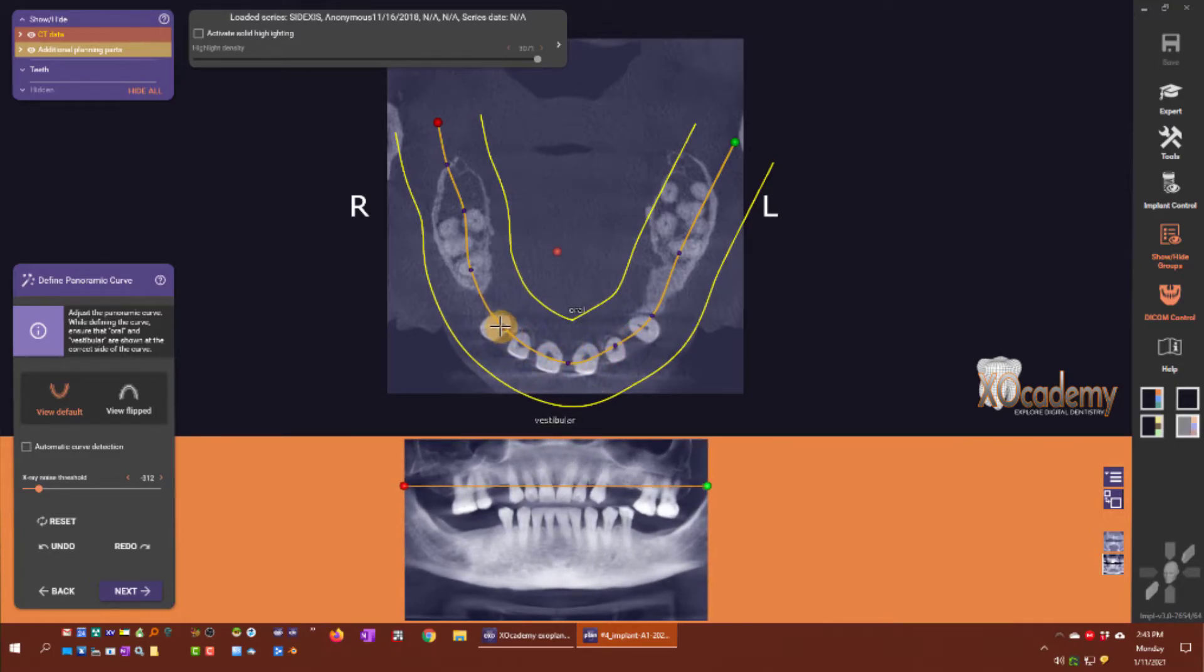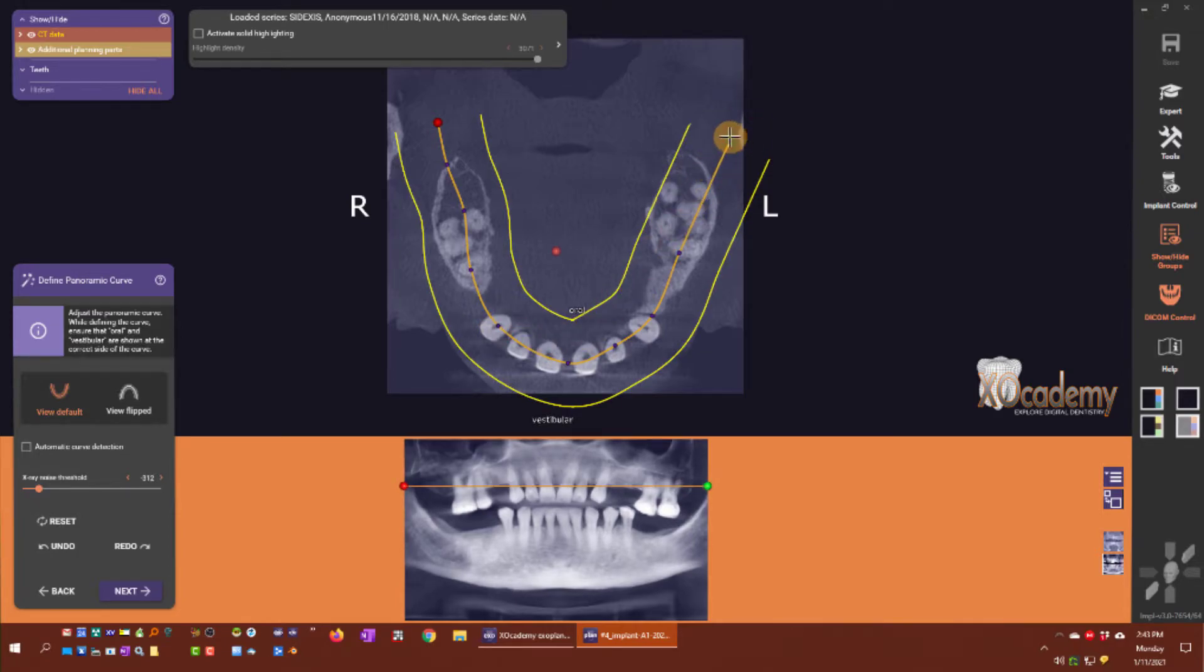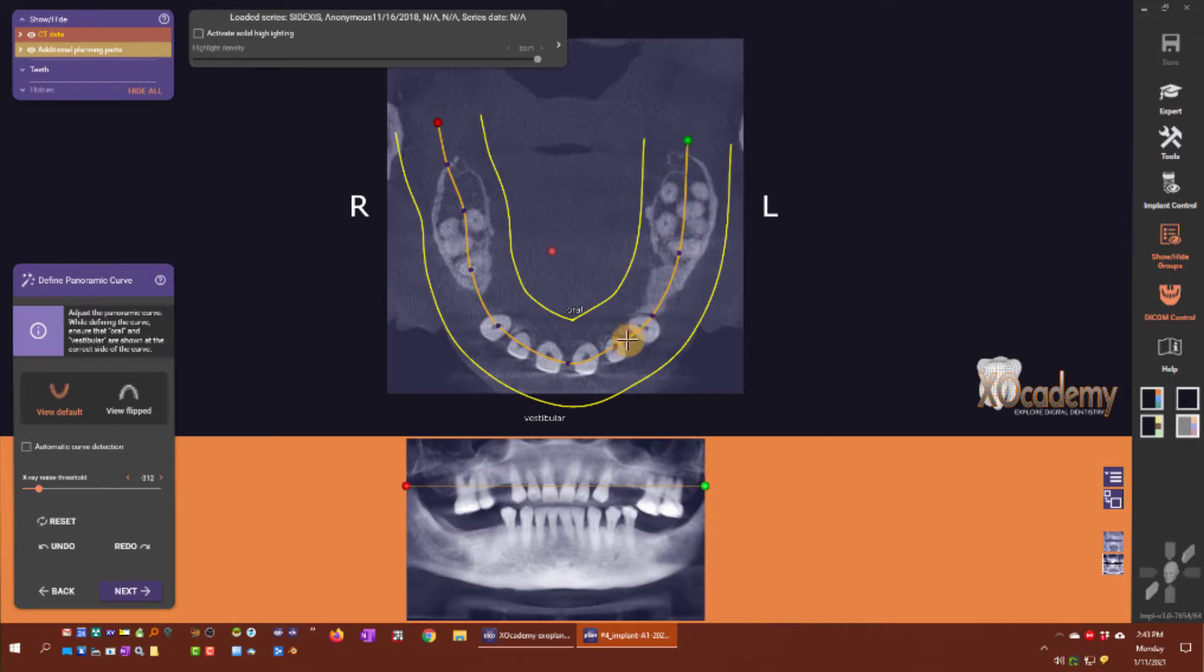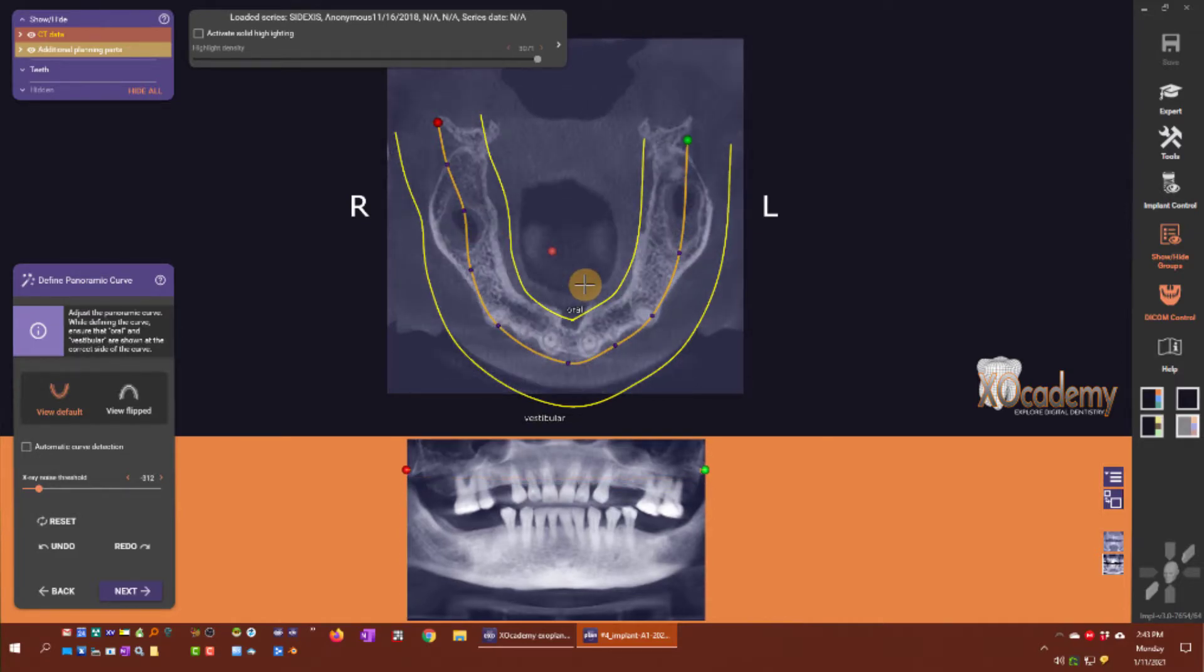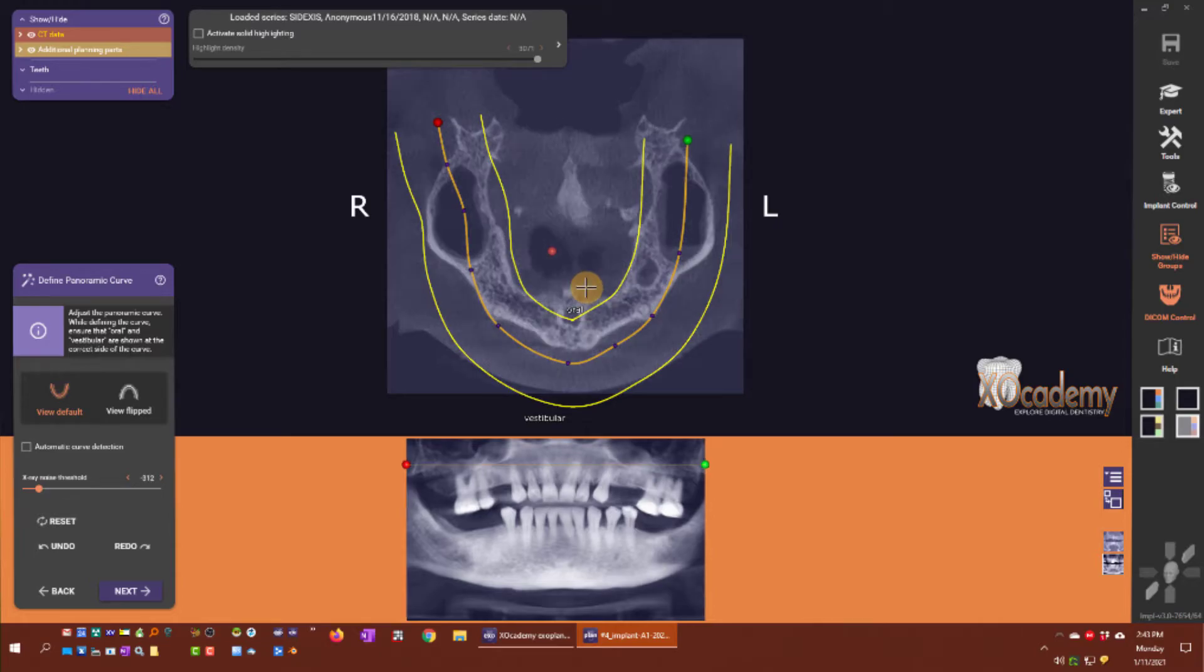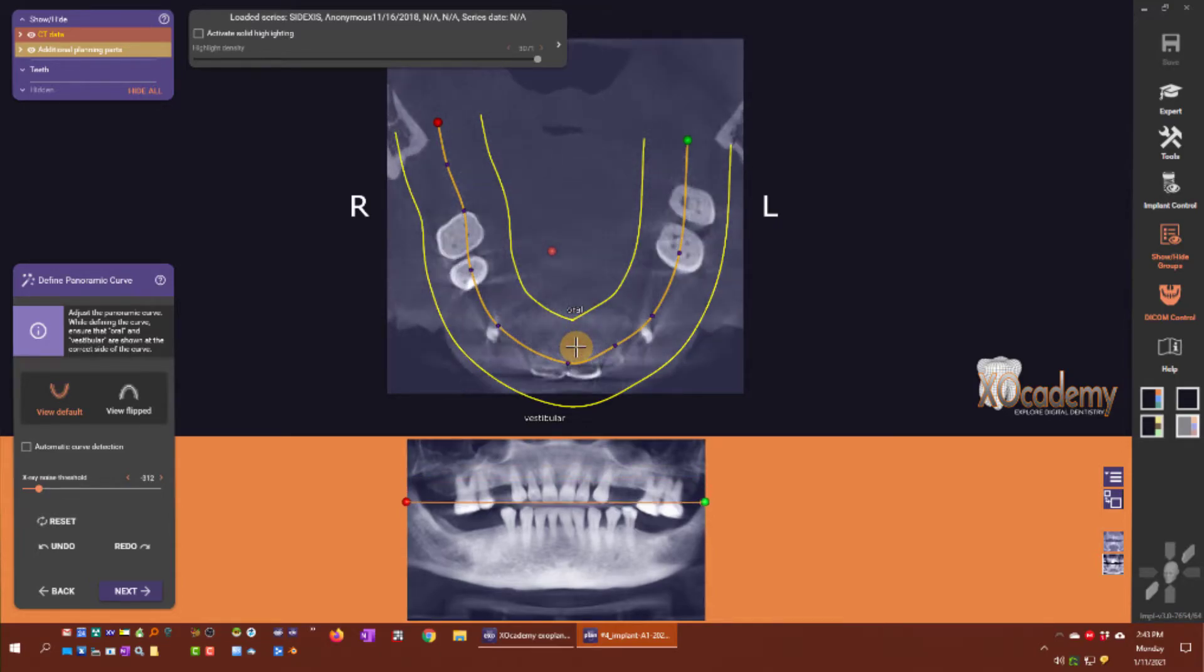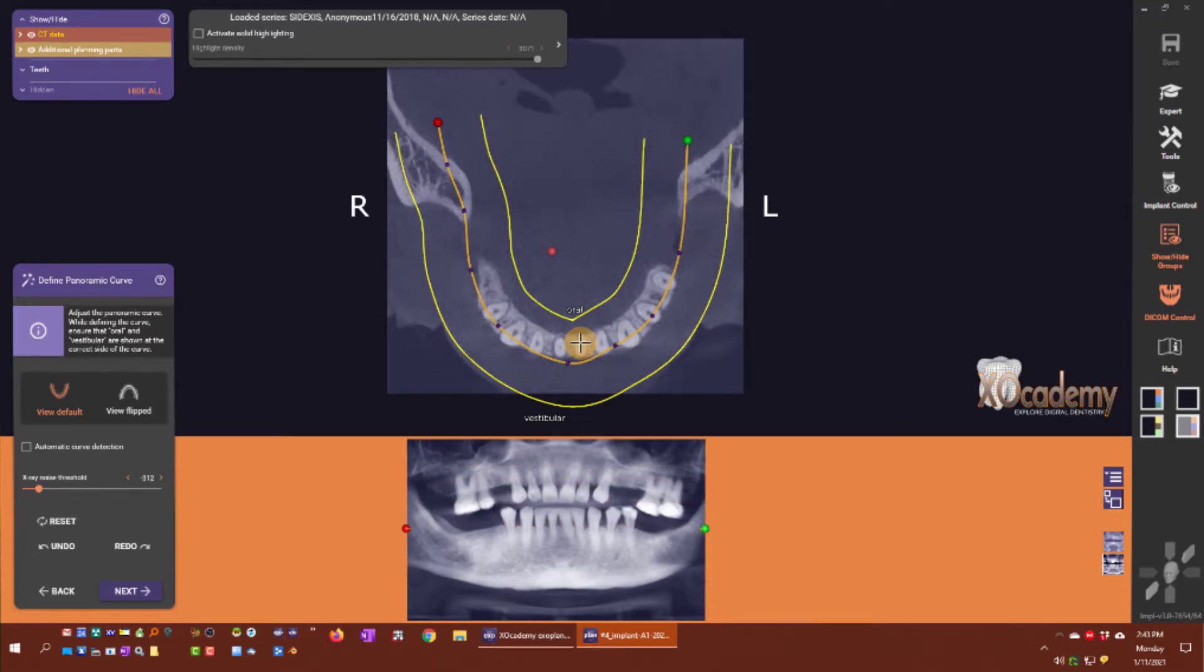So I might think that this is a much better curve for me and the panoramic composite here.